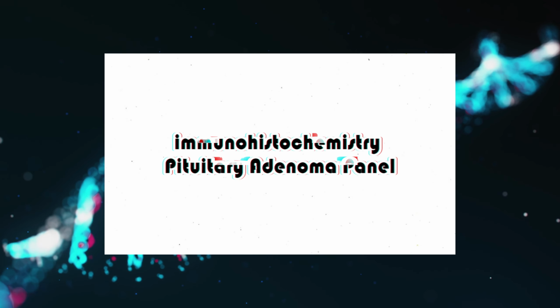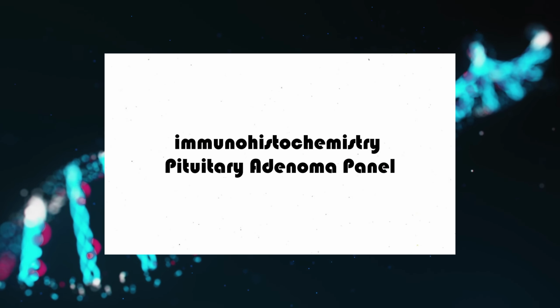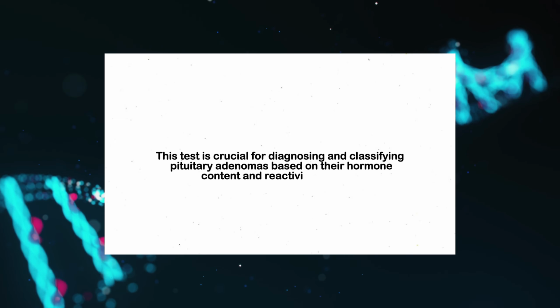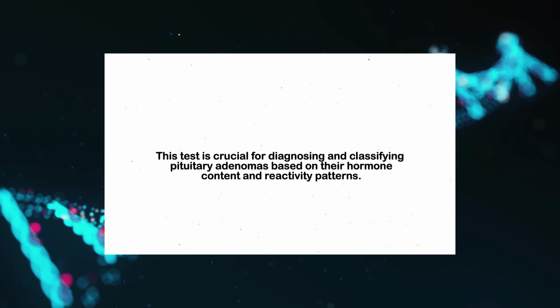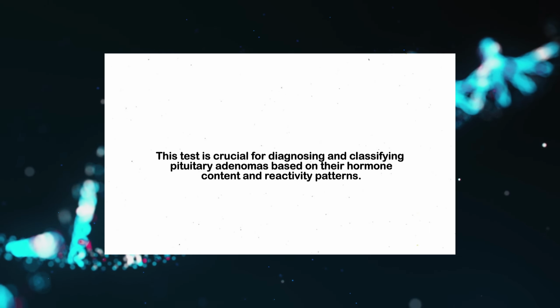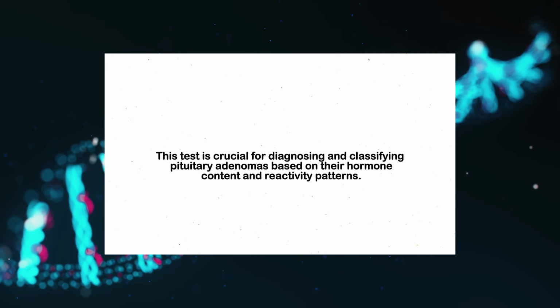We're diving into another important topic in immunohistochemistry, the pituitary adenoma panel test. This test is crucial for diagnosing and classifying pituitary adenomas based on their hormone content and reactivity patterns. So, let's get started. Pre-test information.